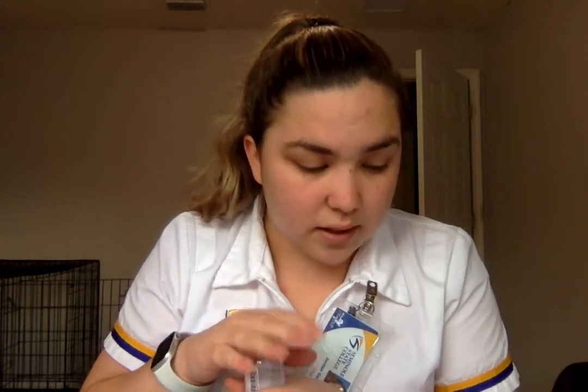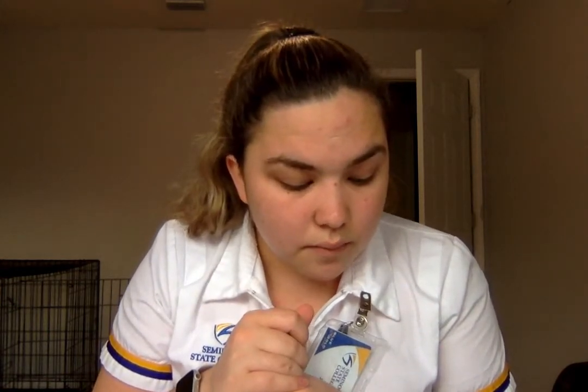So then once I've taught her about her medications, I will go ahead and do any patient assessments that I need to do for that. I don't really need to do any patient assessments for these. So I'm going to go ahead and now do my 3rd and final med check. I'm going to start with my influenza vaccine. I have the right med, the influenza vaccine, the right patient, Anna Powolowski, 5/5/1957. Right dose, 0.5 mLs. I've already have it drawn up. Right route, intramuscular, and right time, 14:58. So I did my 3rd check on that one.